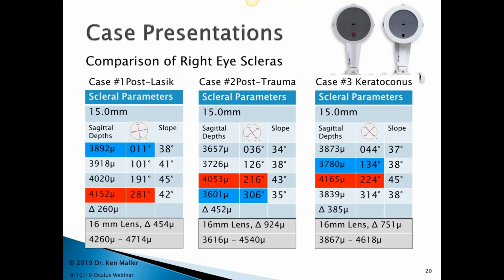Okay, great. Thank you. Sure. We have several questions that are asking what the average prescription or how you would decide to use a scleral contact lens versus another type of contact lens.